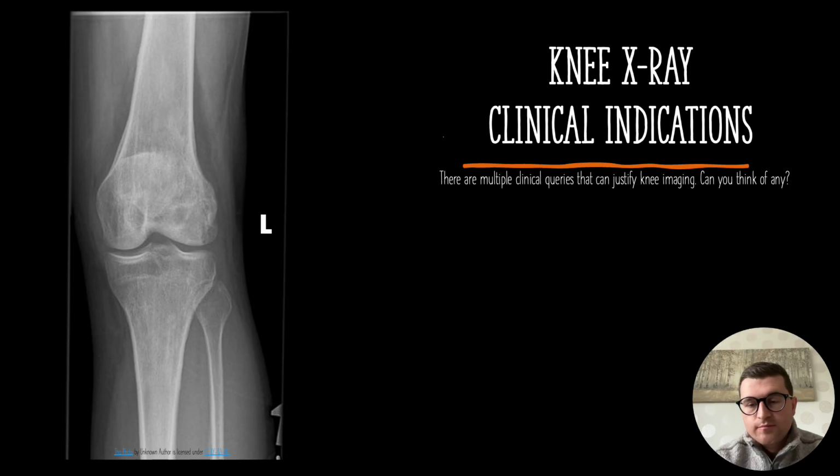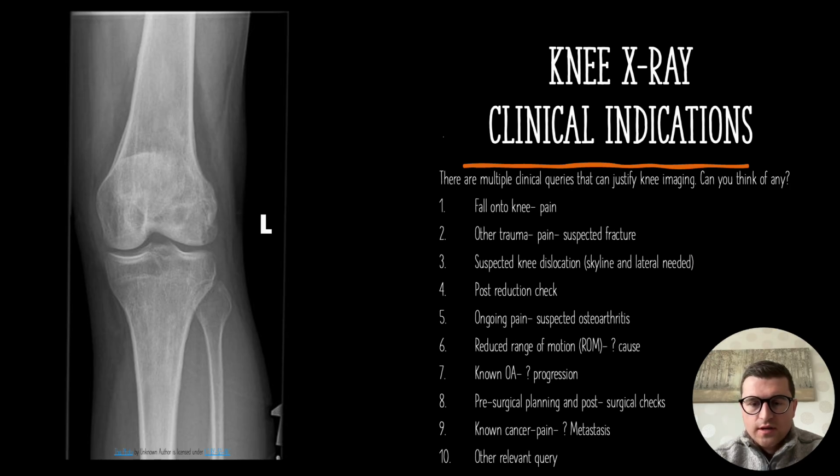Before we move on to the radiograph itself, it's very important to understand what we can actually justify knee imaging for. There are various clinical queries that will come through the imaging department that you can accept and justify knee imaging for. So have a wee think about some before I put up the list. I have a list of 9 here, and 10 is obviously other relevant queries.